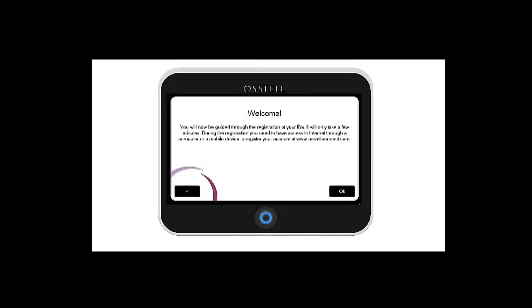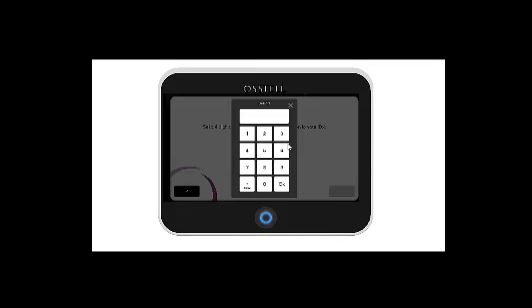During the registration, you will need to have access to internet through a computer or a mobile device to register your account at OsstellConnect.com. You will be prompted to select a 4-digit PIN used to log into the instrument.